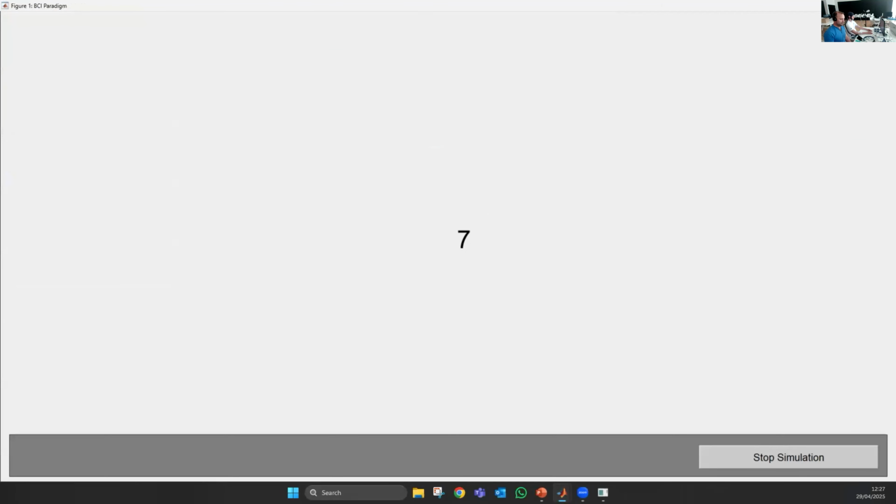So Evgeny can see this screen now. I also activate the stimulators. He sees the fixation cross, and now it's asking for imagination of a left hand movement, and while he's doing the imagination, he gets the stimulation on the corresponding side.